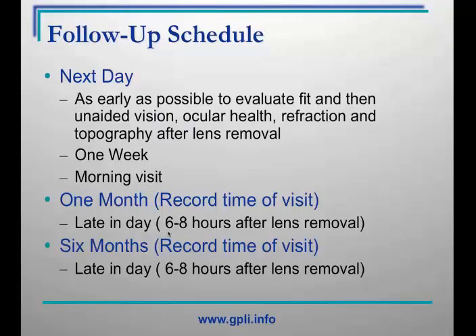You can also see them 3 days later if at 24 hours you don't feel you're getting complete treatment, to see if you're getting treatment or if you need to reorder or refit. And it's also important when they do come back for their 1 month and 6 month visits to bring their lenses to ensure that in fact their lenses are clean and they do not need to be replaced.